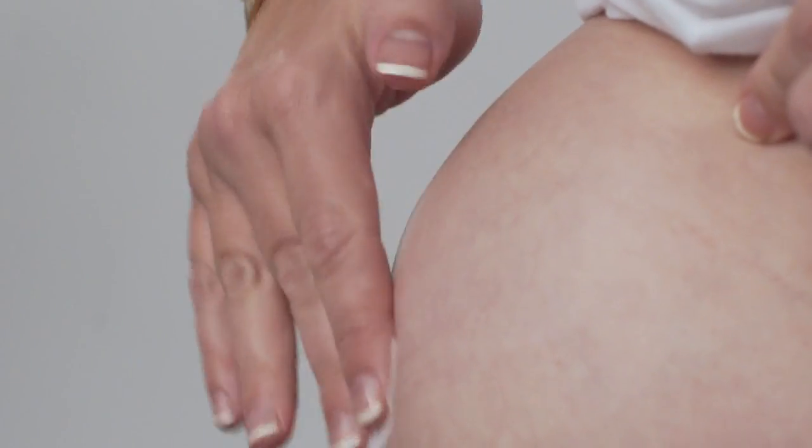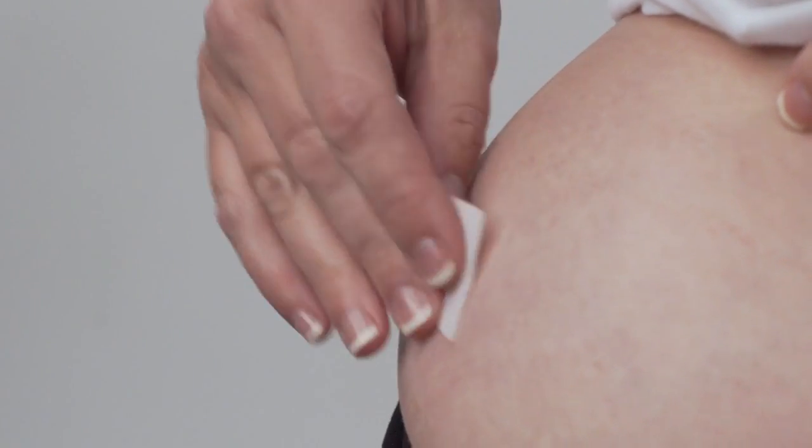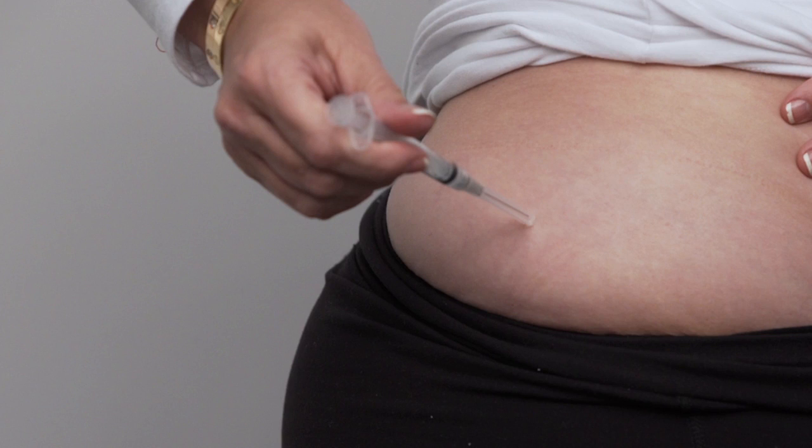Choose an injection site as directed by your healthcare provider. Common sites for intramuscular injections include the hip, upper outer quadrant of the buttocks, and the outer area of the mid-thigh. Clean the injection site with an alcohol swab and allow to air dry. You should alternate injection sites each day. Hold the syringe in your hand like a pen or pencil, and use the thumb and index finger of your other hand to gently spread the skin at the injection site.